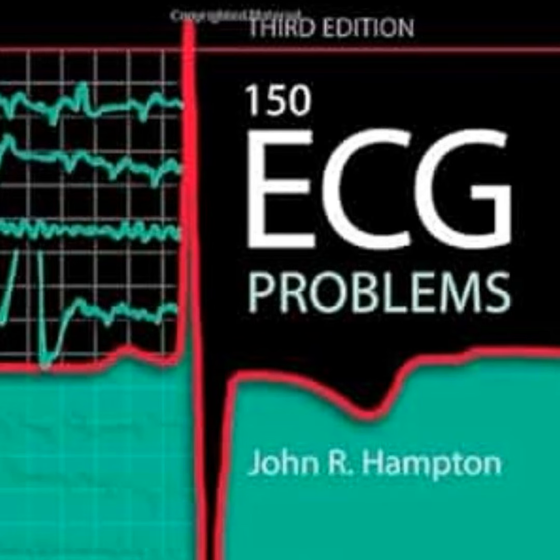So if a clinician just looked at the strip, merely saw the extrasystoles, and administered an antiarrhythmic without actually checking the electrolytes in the medication history. They would be completely ignoring the fundamental mechanism of the arrhythmia. They would basically be treating the smoke and completely ignoring the fire. Man, that's a powerful way to put it. Treating the smoke and ignoring the fire.